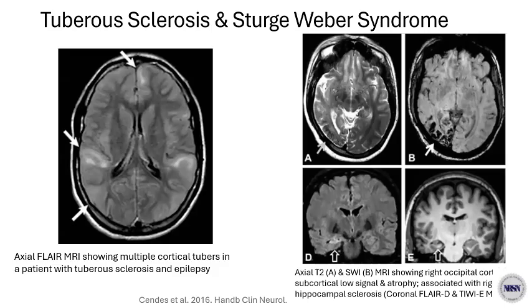You mentioned arterial spin labeling being complementary in the diagnosis of epilepsy. Are you doing it commonly in your setting for that diagnosis of epilepsy? Okay, thank you very much for the question. Actually, arterial spin labeling MRI is one of the advanced imaging modalities that are used in the diagnosis of epilepsy, but it's not meant to be done routinely.